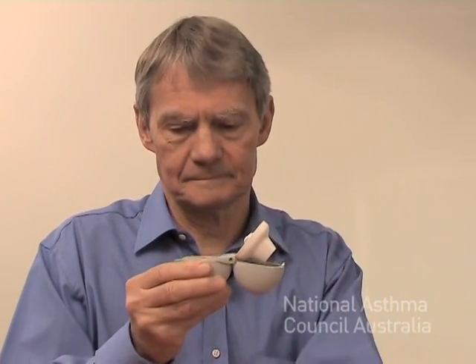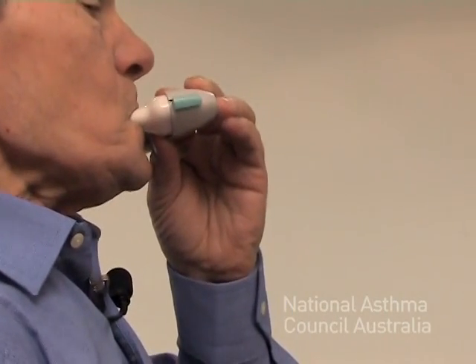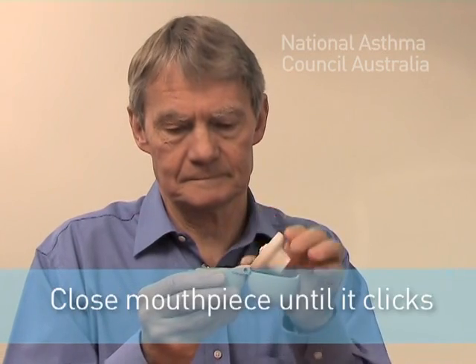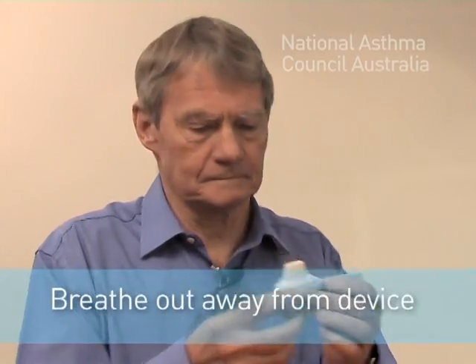Do you want to show me how you would use your handi-haler? I don't know.